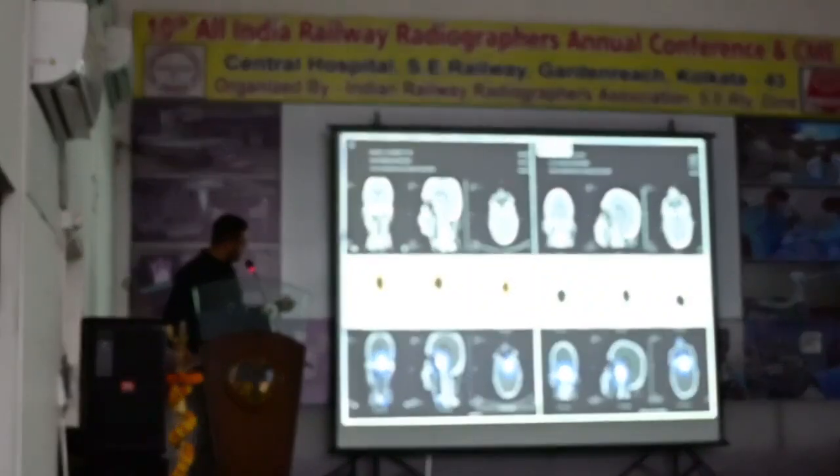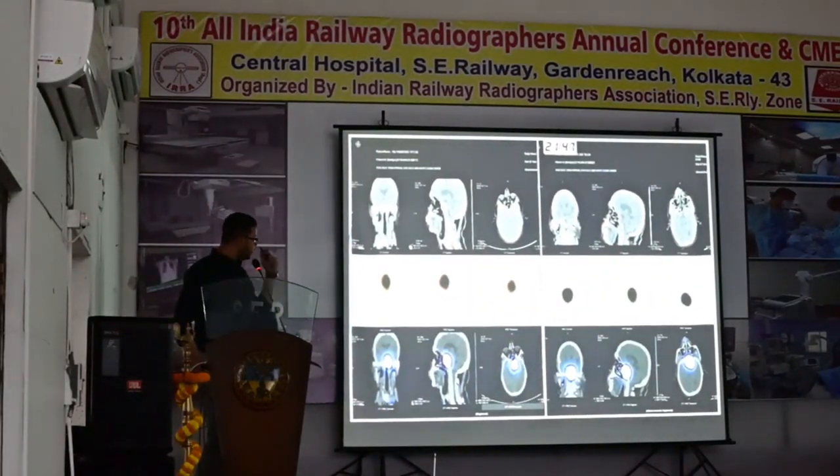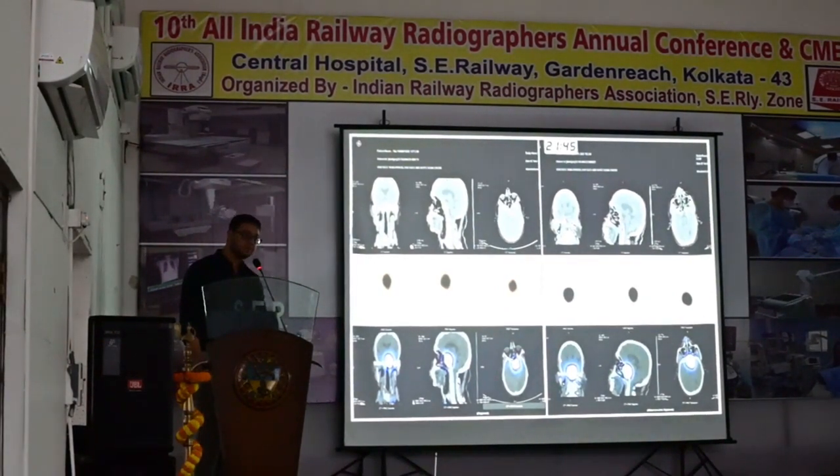Till now we were seeing a patient with a follicular thyroid cancer scan, and this was the scan at the baseline, and then this is the uptake in the neck that was there. This is the residual thyroid tissue after surgery, and this was localized to the area of the clivus, causing destruction of the clivus and abutting the optic chiasma.